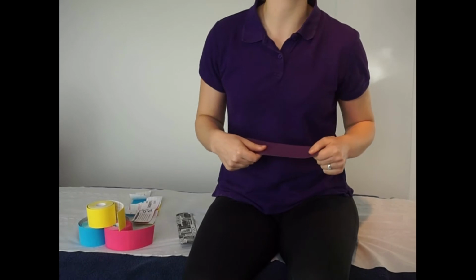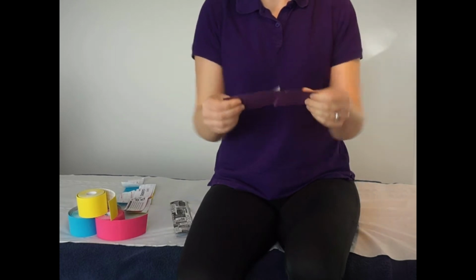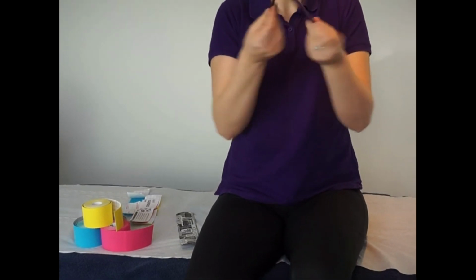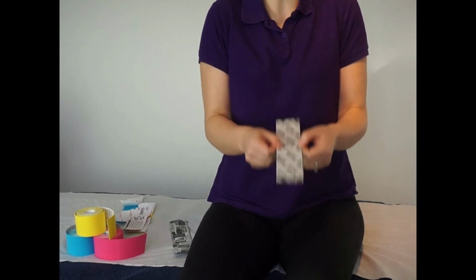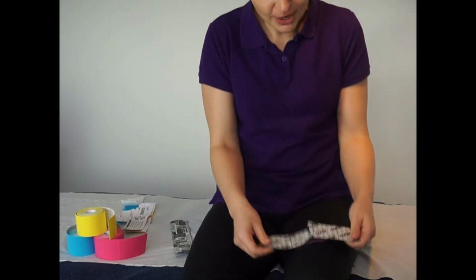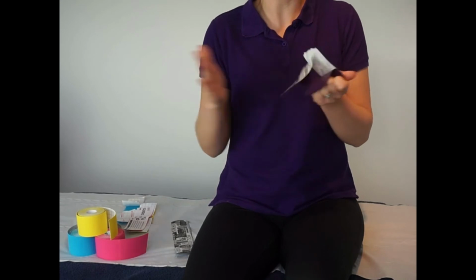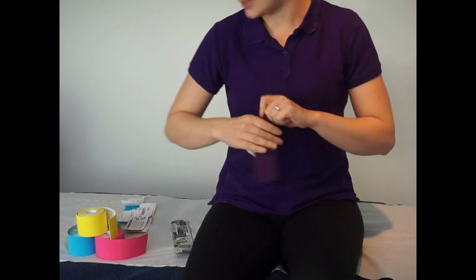So coming into the higher end of the market now, so we're going to go with this tape first of all. So again, breaking the tape, the tissue and the paper away from the tape, and I pull. So there's a lot more recoil back on this tape. And what's good about this is actually the paper isn't coming away. So if I just put that back down, you can see that there's no gap. So it's recoiled back to where we want it to be. But if I pull really hard, it's coming away a little bit, but it's not as much. And then if I go into the stickiness, as you can see, it's very sticky. It's sticking to the tape on the other side, but also you can hear there's a lot more stickiness to that tape. That's going to last a lot longer for your clients.